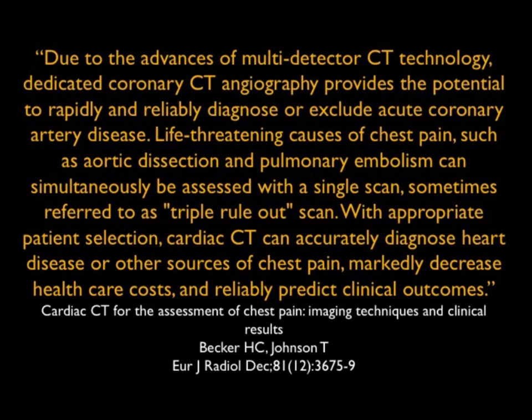With appropriate patient selection, cardiac CT can accurately diagnose heart disease or other causes of chest pain, markedly decreasing healthcare costs and reliably predicting clinical outcomes. So that's really the best of all worlds.